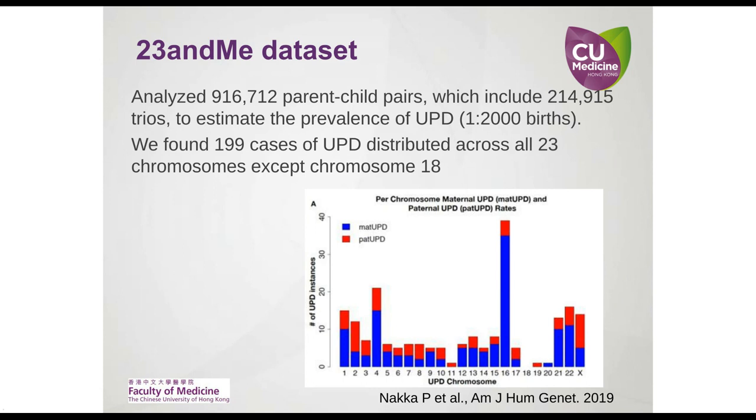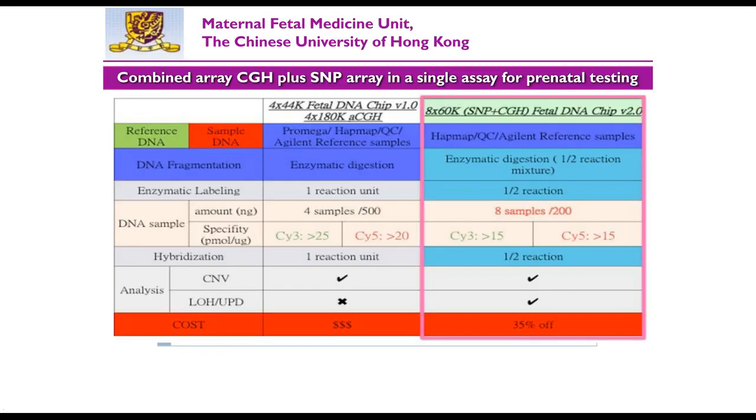It can go all across all the chromosomes, and it could be of both paternal and maternal origin. So identifying this information is very important, particularly if there's a possibility of an autosomal recessive condition. To address that, in our custom array we are also including an enzyme digestion step so that we are able to enhance the detection of the SNPs as well.